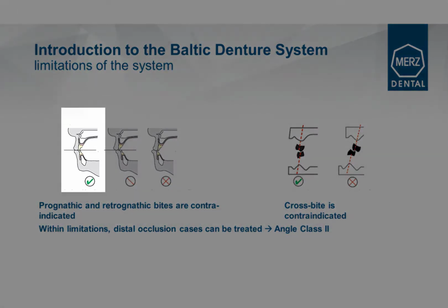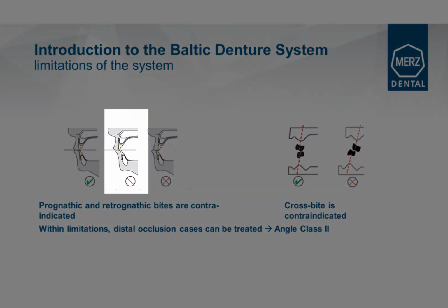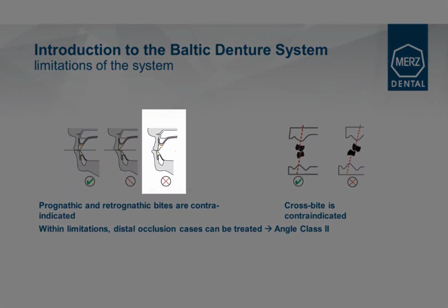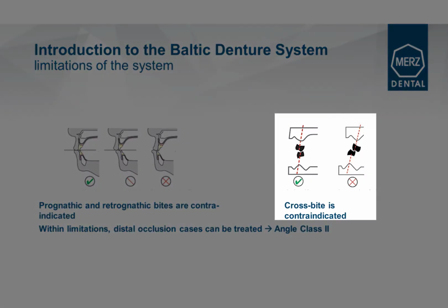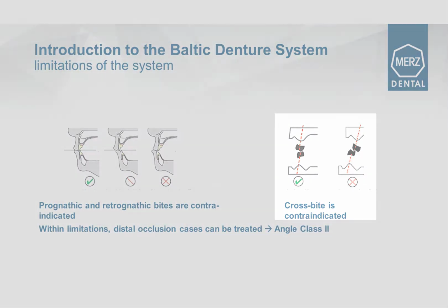The setups offer an ideal solution for Angle class 1 situations. A distal shift of the lower jaw can still be solved within limits. A forward displacement of the lower jaw and Angle class 3 cannot be resolved. Also, a crossbite situation can't be served.